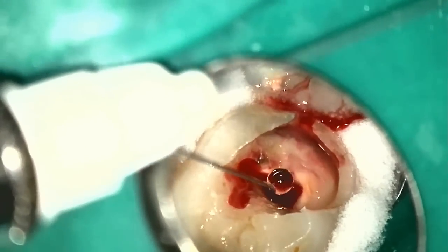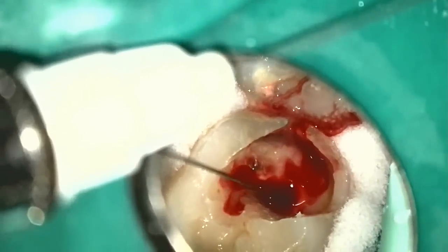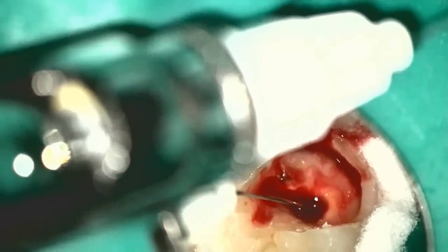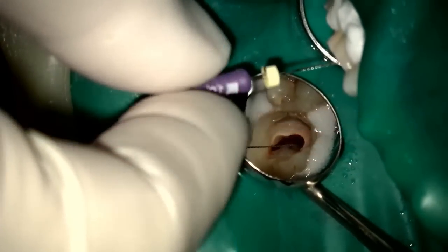Before I do, the patient noted with my microsuction that she was feeling sensitivity of the nerve. So here we go with palatal canal pulpal anesthesia, just to get the patient numb. This is an important thing to do to make it so you can work comfortably.